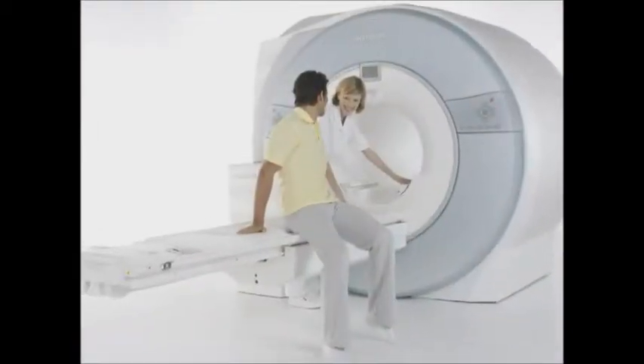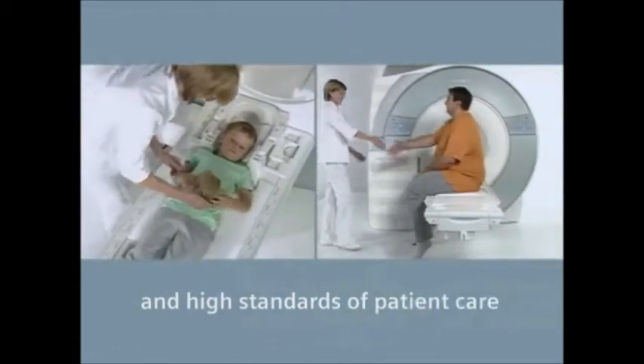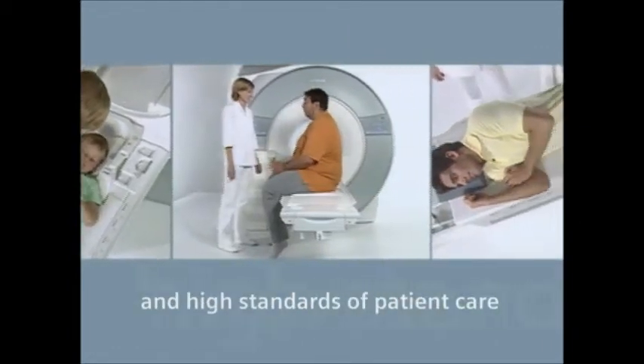Magnetom Vario was created to help you meet your demanding clinical needs along with your high standards of patient care, today and well into the future.